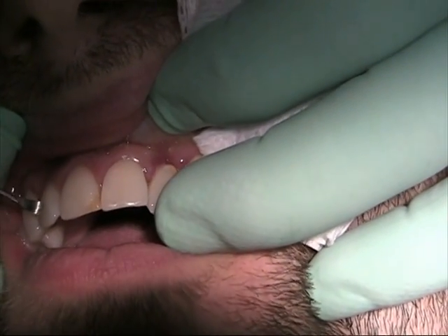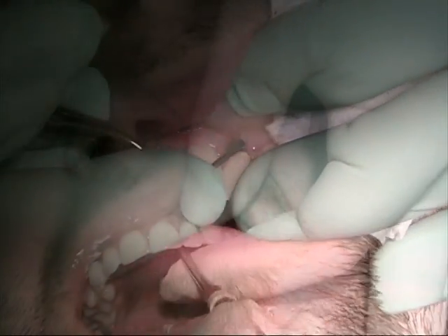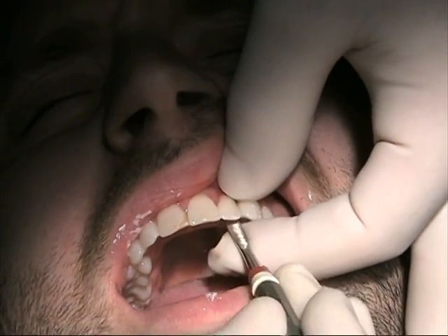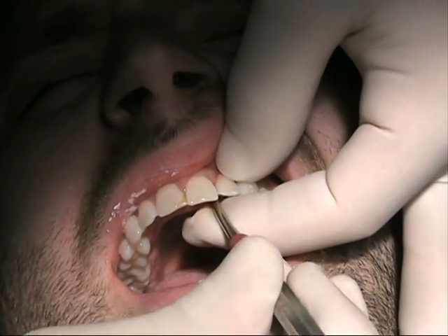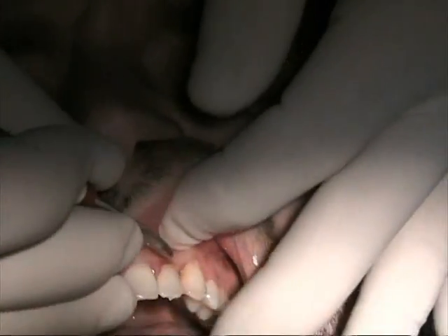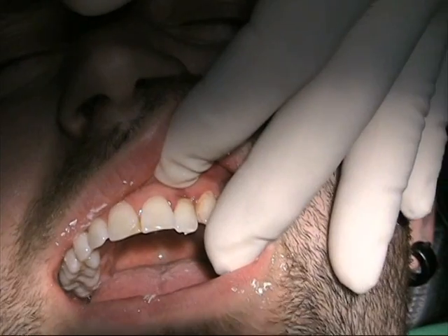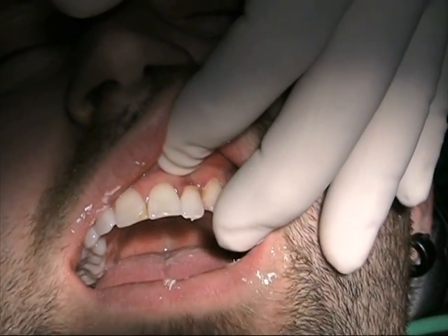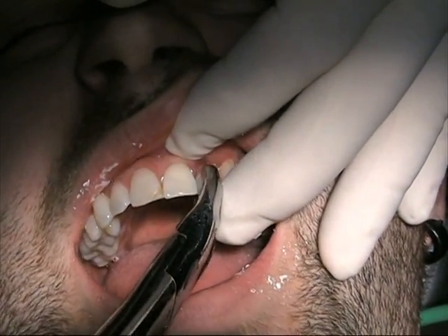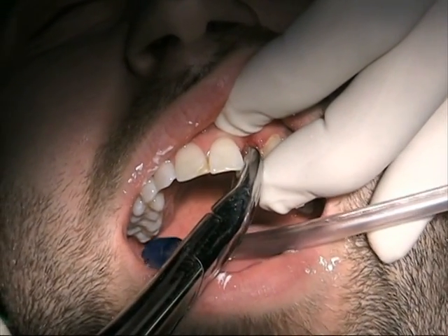Just as a note for the future, this tooth will probably go down the same road and at some point we might want to get to it before it gets to this stage. At this point we're just rotating the tooth with a periosteal elevator. There's really not a lot holding it in here and there's no real risk of fracturing any facial plate because that's essentially gone. So it's going to be just basically a quick twist and remove, which we shall do right now. And then we'll be able to identify the amount of damage.